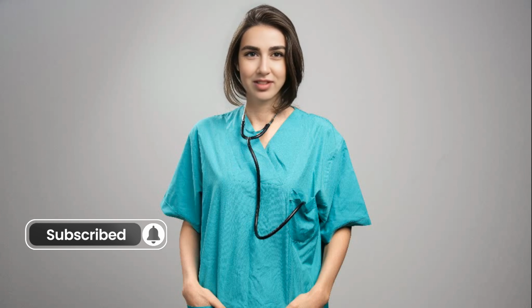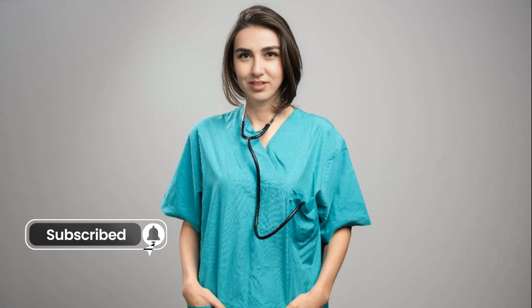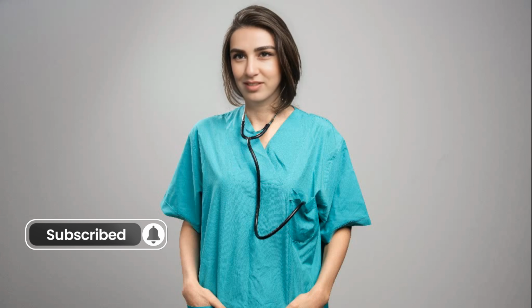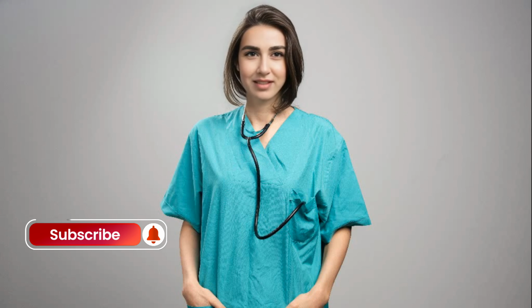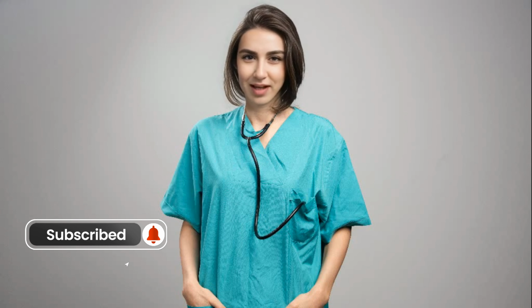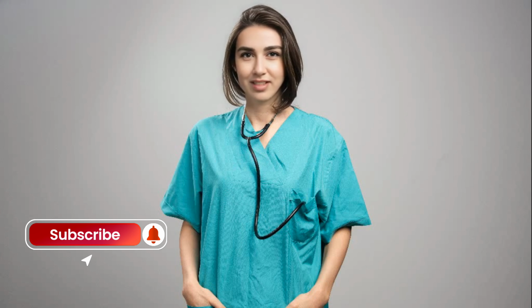4. Capturing images. X-ray images, angiograms, are taken as the dye flows through the arteries. These images show any blockages or narrowing in real time. Based on these images, the doctor determines the severity and exact location of the blockages. 5. Evaluating the results. If blockages are found and deemed treatable, the doctor may proceed immediately to perform angioplasty.